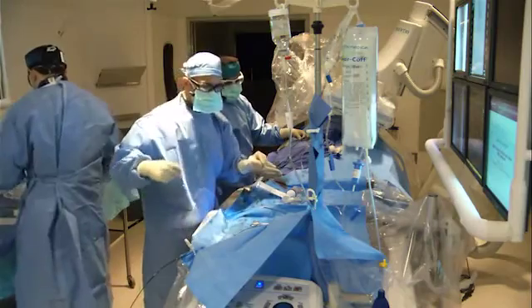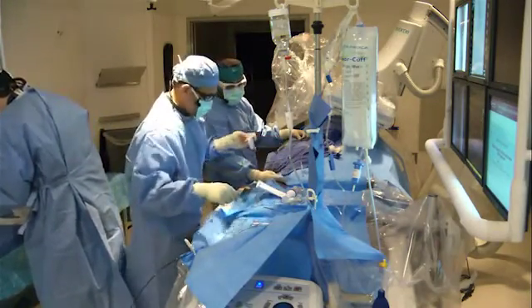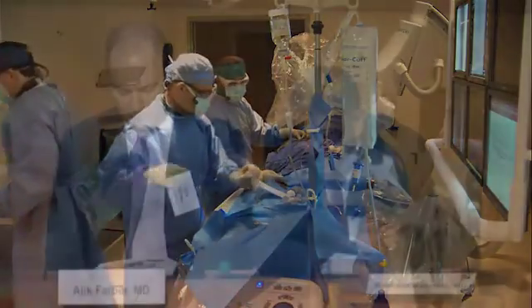I think occluding the profunda was very educational. Don't you think so? Absolutely, but I just have a suggestion, a personal one. You can take it for whatever it's worth. I would not be shy in the length of the Viabahn. I think you should not try to just nail that segment. Maybe cover a little bit more proximal, not so much distal, of course. 15 centimeters.